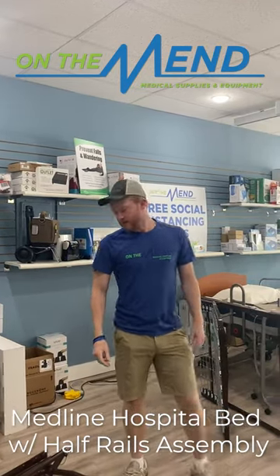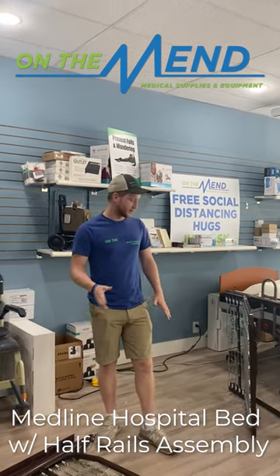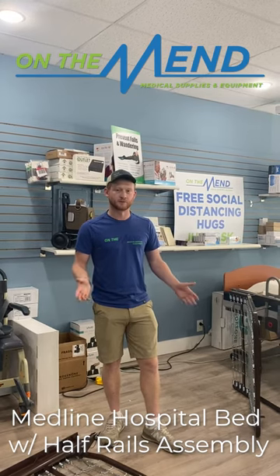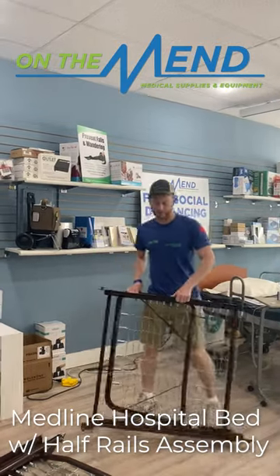Hi everybody, Collin here with On The Mend. Today I'm going to give you a walkthrough on how to put together a Medline Hospital bed. The beauty about these beds is whether it's Medline, Drive, or whatever other company, they're basically all the same when you're going to put them together. Normally this would be easier with two people, but it is doable with one. I'm going to show you how to do it if you're alone.